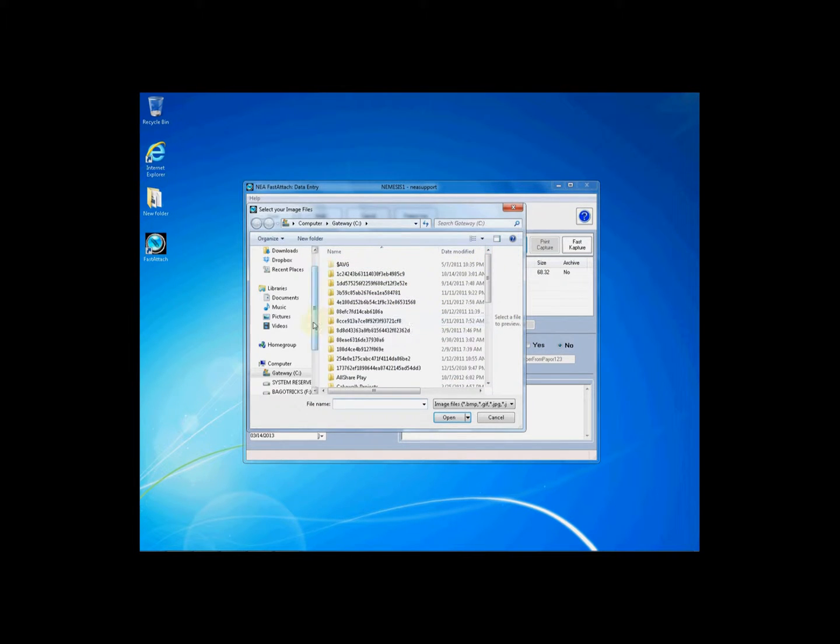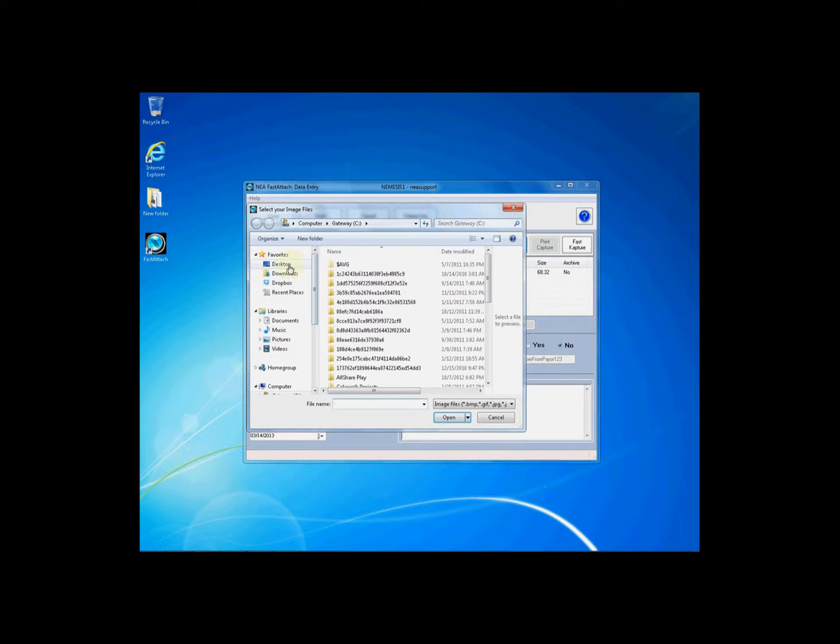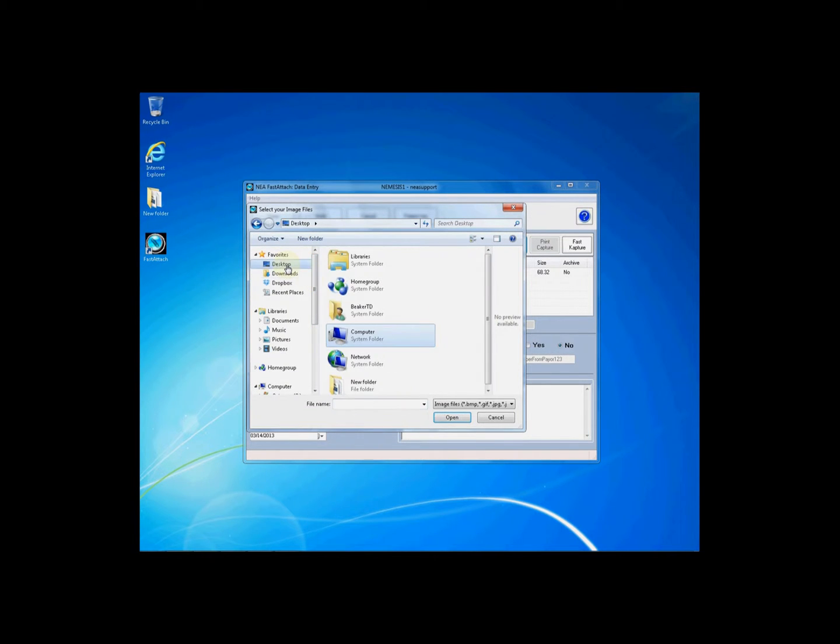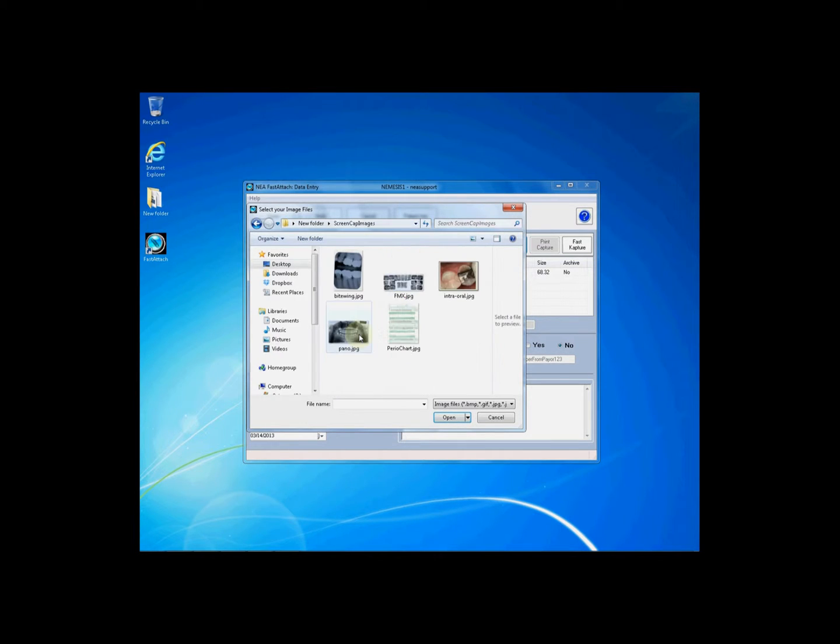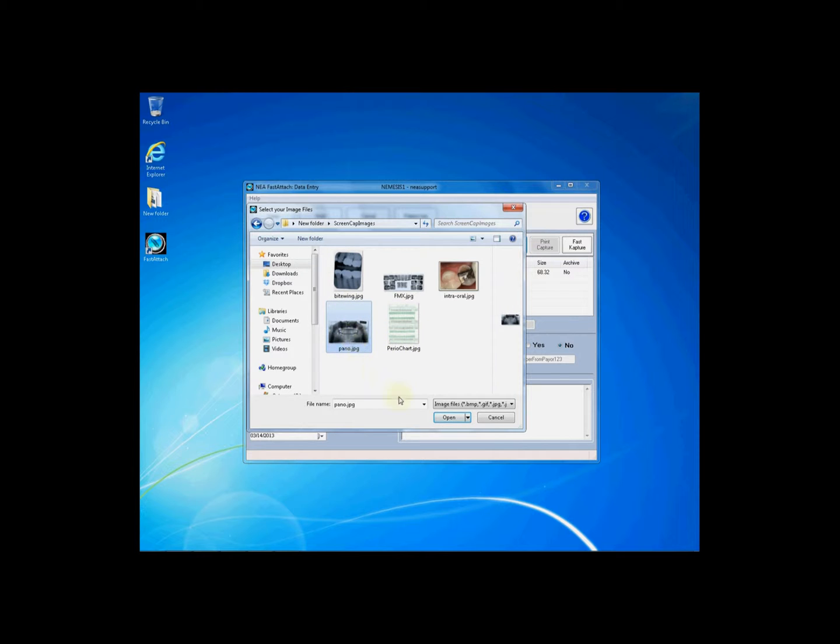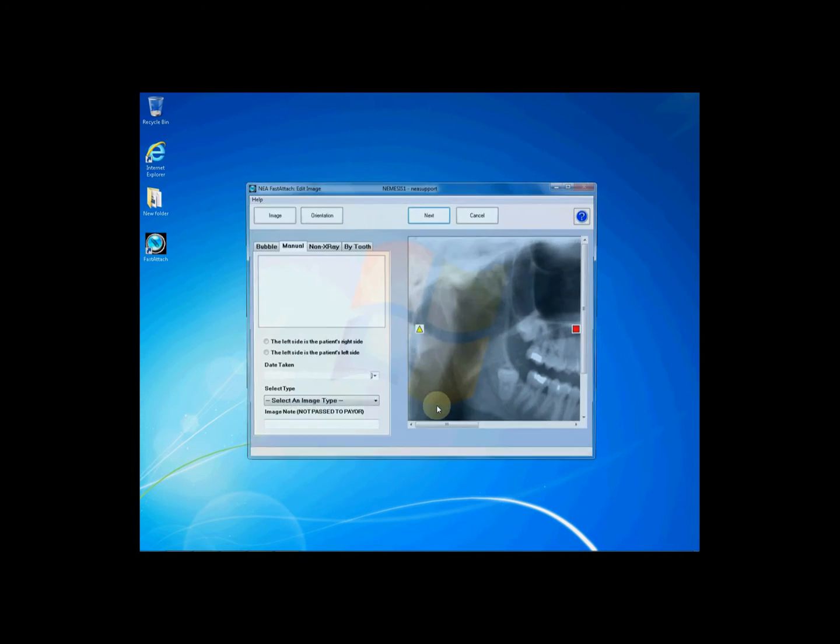Once you click File Import, an Explorer window will open allowing you to navigate your computer to where you have stored your x-rays and documentation. Please make sure your images are accessible and in the right format such as a JPEG. Once you find the documentation you wish to send as an attachment, simply highlight it and click the Open button or double-click the image.